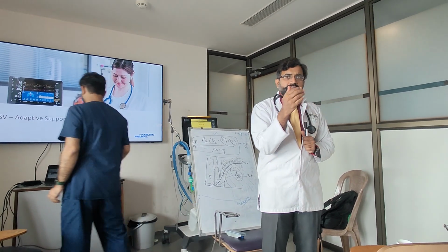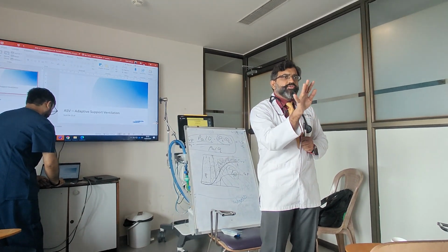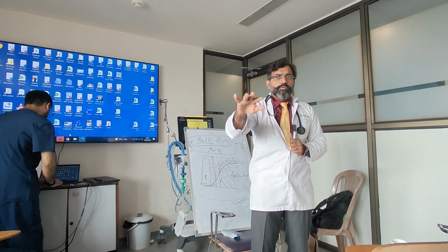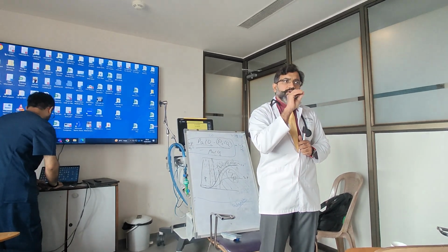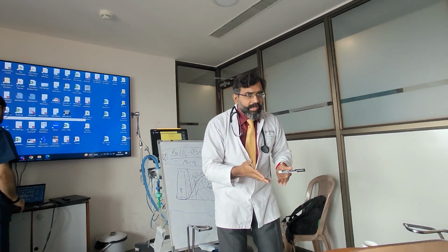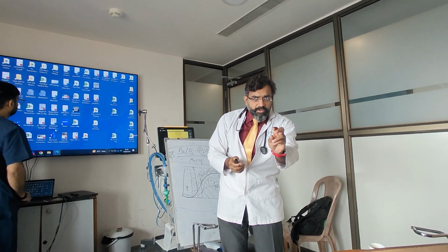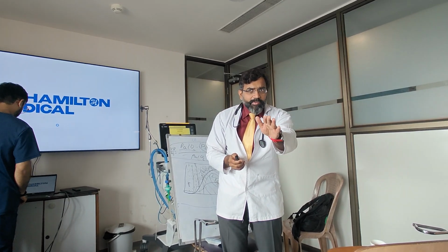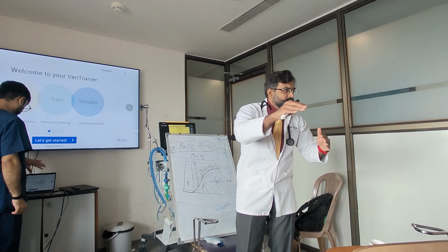You understand? PRVC. It's a kind of a small closed loop where if the pressures are going up, I am changing the flow characteristics so that I get the pressures very well regulated and give the same volume. That is a knowledge-based system, where a small closed loop from the patient is going to the ventilator saying that the pressures are increasing, reduce my pressure. Your pressure control ventilation is a knowledge-based system. Why? You have set a pressure, say 20, and to maintain that pressure there is a continuous feedback from the sensor to maintain 20. That's a closed loop.